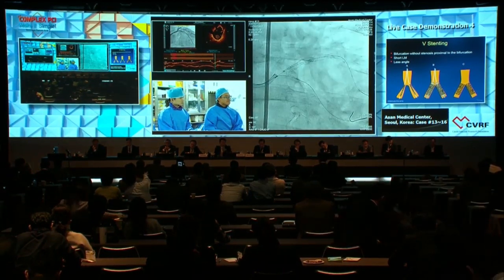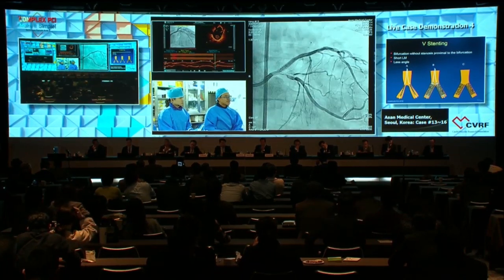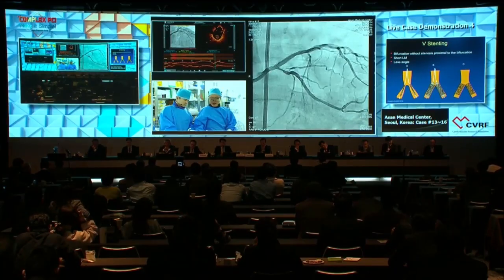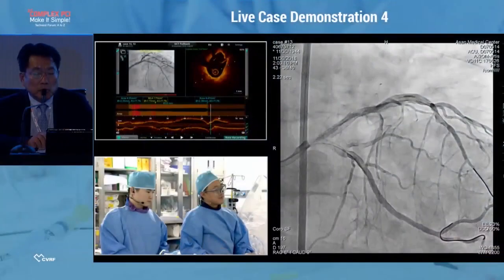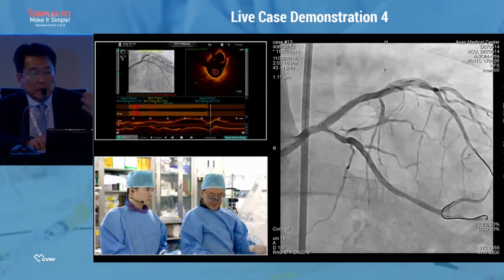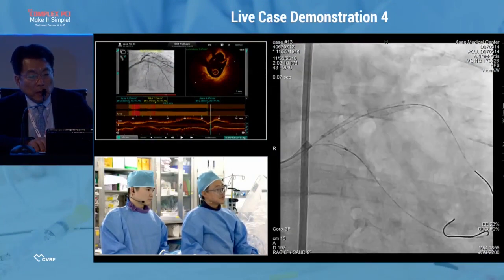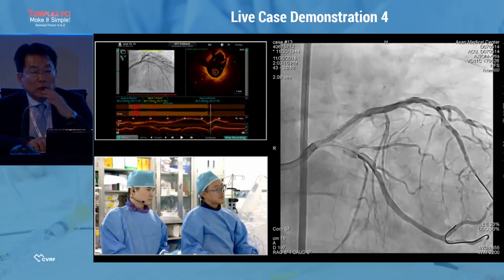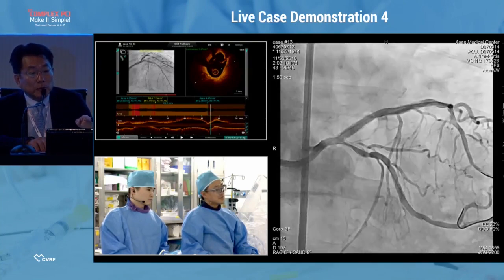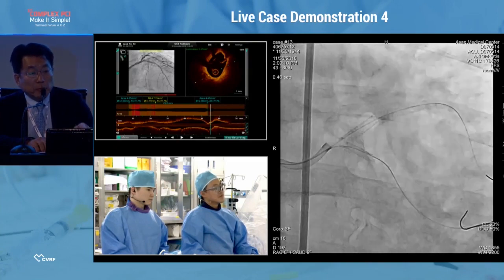So you have already done DEB? Not yet. All right, so that is our final step. My suggestion is DEB again. I don't want a double drug stent for a relatively unexpanded, diffuse stented area, so just DEB. And the circumflex concern, even with 0.9 FFR, I believe, right?